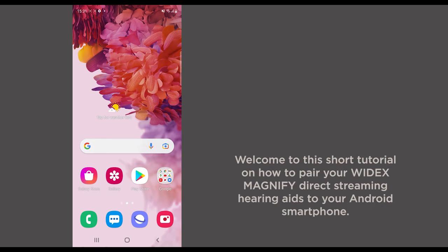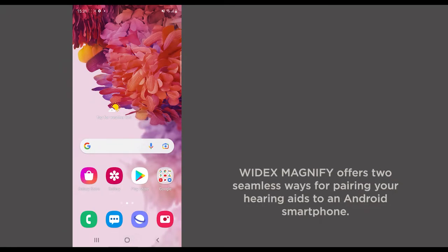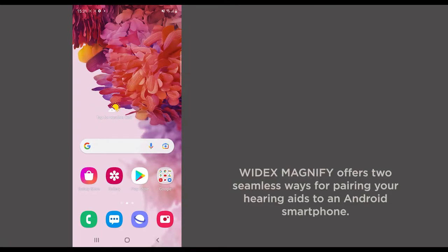Welcome to this short tutorial on how to pair your Widex Magnify direct streaming hearing aids to your Android smartphone. Widex Magnify offers two seamless ways for pairing your hearing aids to an Android smartphone.